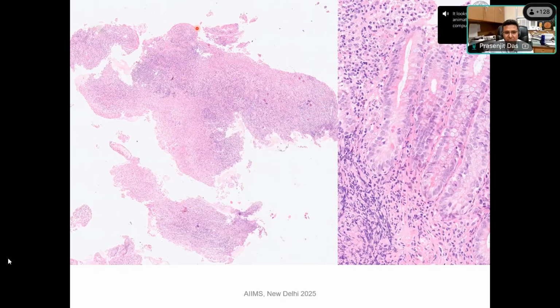We have to identify this residual epithelium. Here also we can see epithelium, but here there is breach of the epithelium. In addition, what we can see, there is dense neutrophilic exudate, and underlying there is inflammatory granulation tissue. So this is definitely an area of ulceration. So we have to identify these areas. Possibly these are also the same areas, and there are some geographical areas. What can you see in this, John?